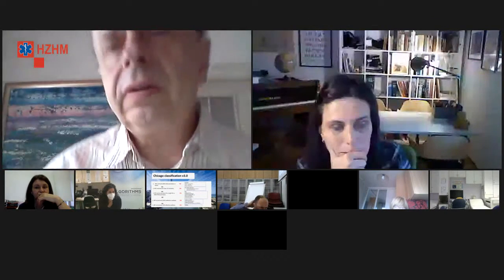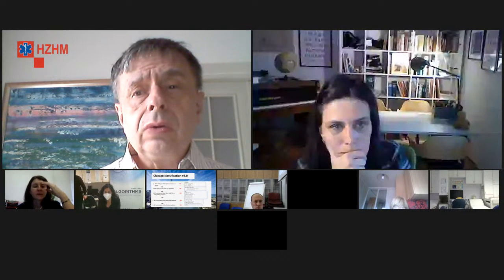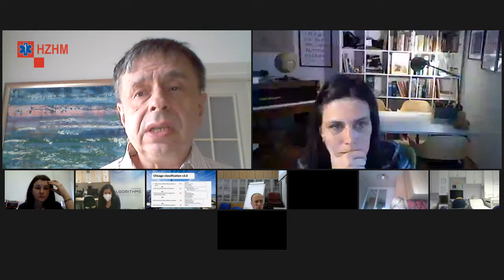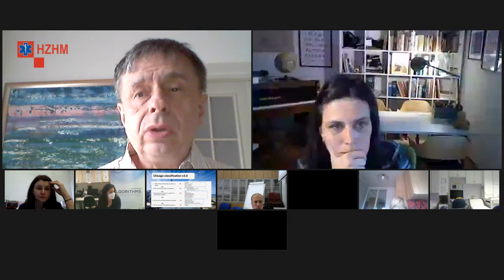U svakom slučaju, visokorezolucijska manometrija, kako može koristiti Chicago klasifikaciju, zapravo vam već sugerira neke stvari. Izračune dobijete gotove. Isto kao kod novih uređaja za pH-metriju, gdje dobijete ukupan broj refluksnih perioda, koliko je vrijednost ispod pH 4, najduži period i u koje doba dana se to dogodilo.